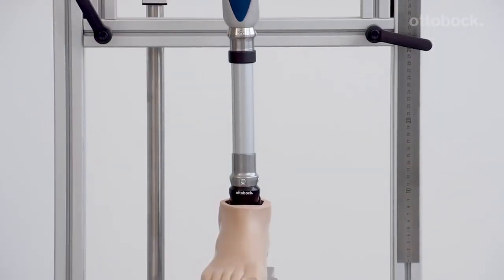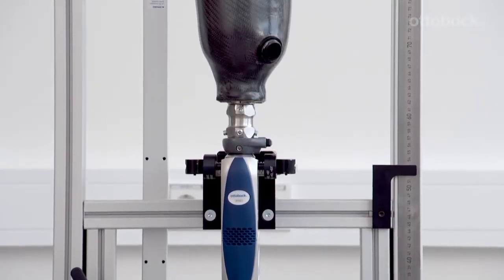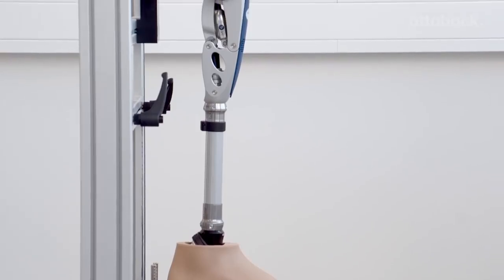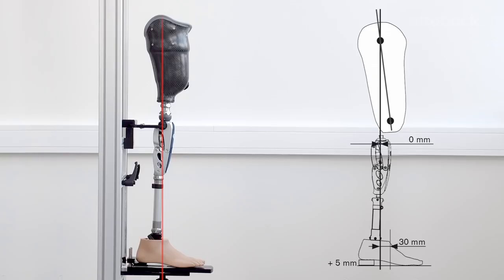The alignment and adjustments are easily completed in the following steps: bench alignment, static alignment, dynamic trial fitting. The alignment reference line runs between the first and second toe, the middle to outer edge of the knee, and the middle of the socket. For the correct bench alignment values, please refer to the displayed table.